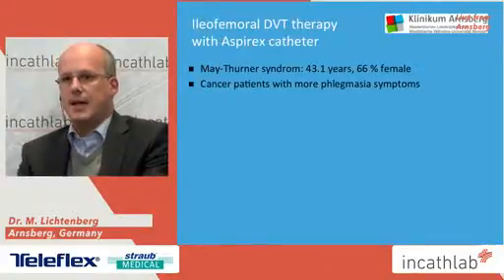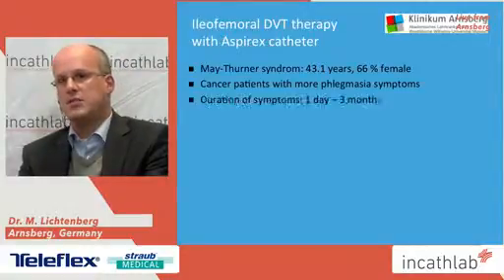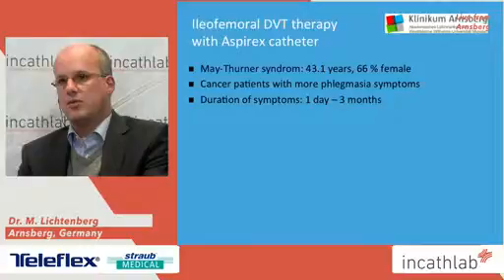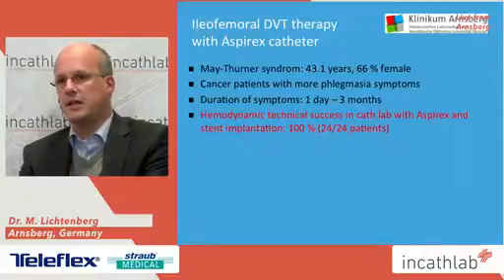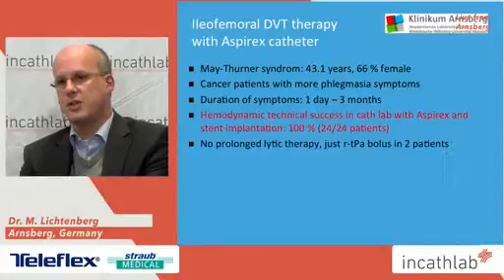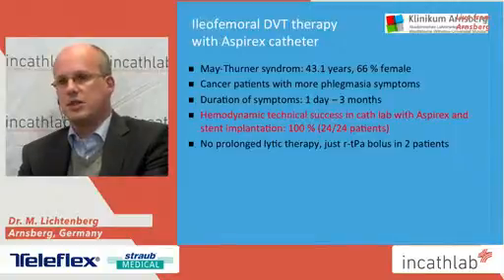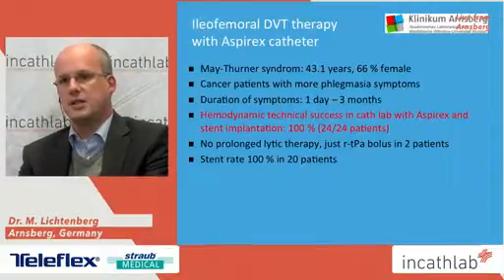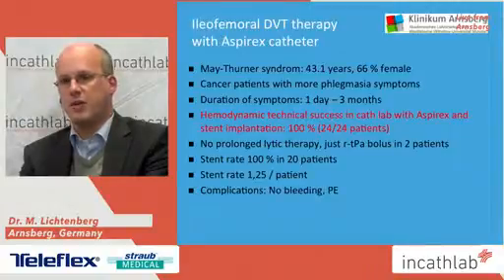What we found out in our patients was that we had more female patients with May-Turner associated DVT. Cancer patients showed up with more phlegmasia symptoms. The duration of symptoms was between 1 day and 3 months. And we achieved hemodynamic technical success in the cath lab with the Aspirex device and stent implantation in 100%. As I mentioned, we did not use prolonged lytic therapy, just a TPA bolus in 2 patients. The stent rate, as I mentioned, was 100%. Stent rate was 1.25 per patient.